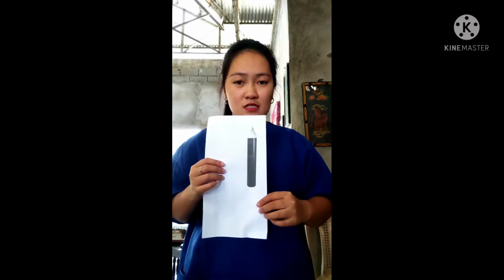Oxygen sources: wall outlets or oxygen cylinder. Let's assume that this is an oxygen cylinder. Tray with nasal cannula of appropriate size or oxygen mask. A kidney tray. Adhesive tape. Scissors. Oxygen stand. Gauze pieces. Cotton swab if needed. No smoking sign. And gloves if available.